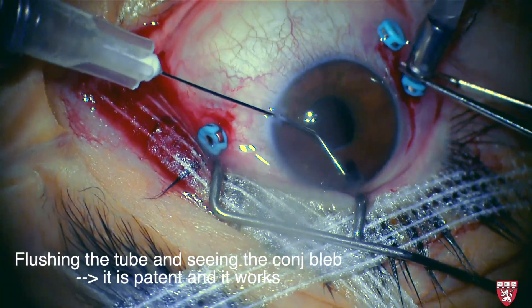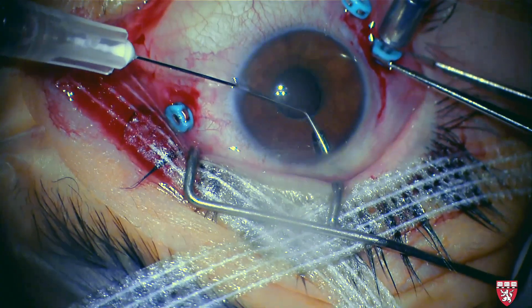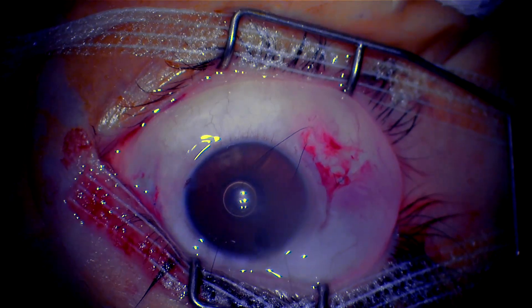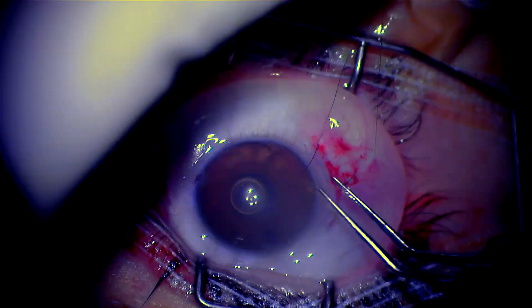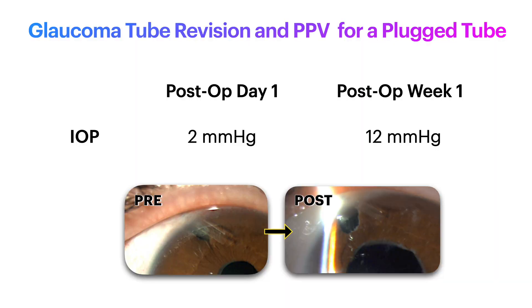Here the tube is flushed and a bleb is seen, indicating that the tube is now patent and functions properly. At the end of the surgery, all sclerostomies were closed to prevent hypotony in the setting of a functional shunt. On post-op day 1, the patient's IOP was 2. As expected, the IOP normalized to 12 within 7 days, indicating a successful surgery.